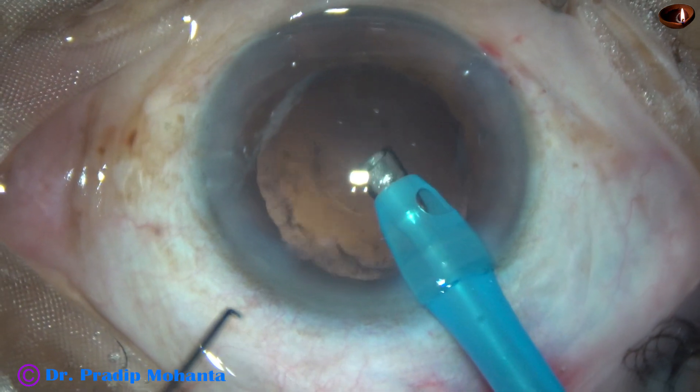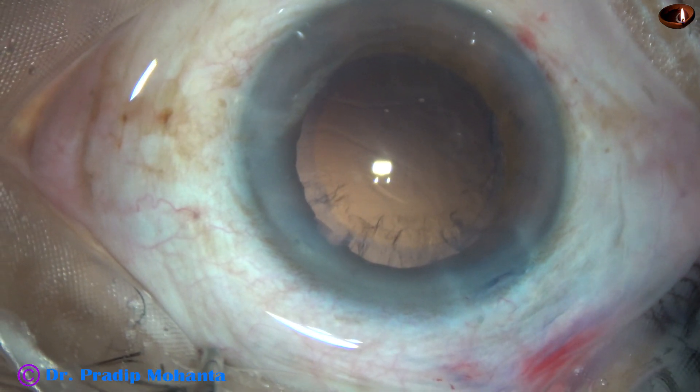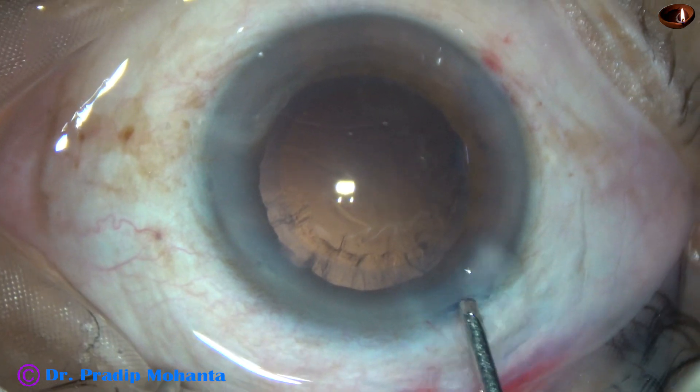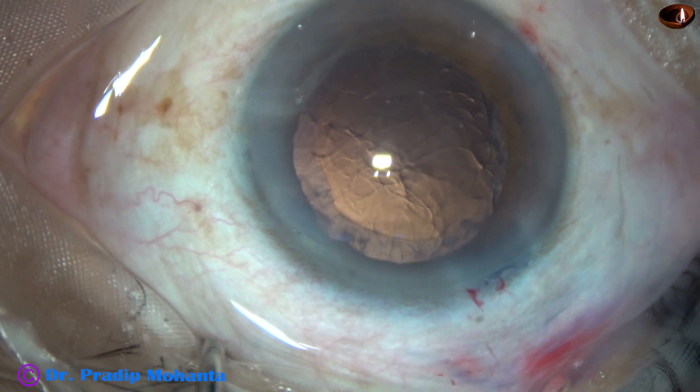The aim of this video is this: we can emulsify the nucleus and leave the epinucleus for removal at the last moments.